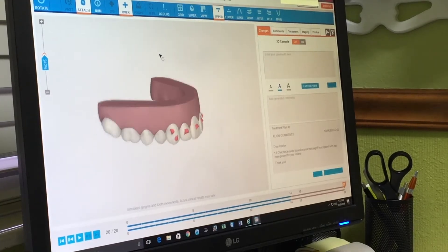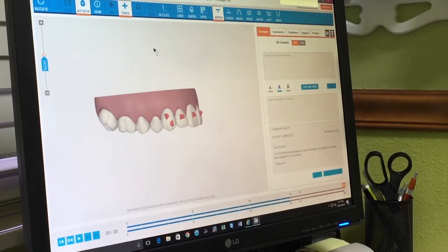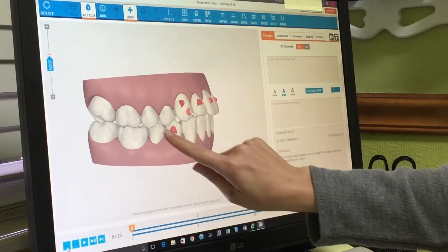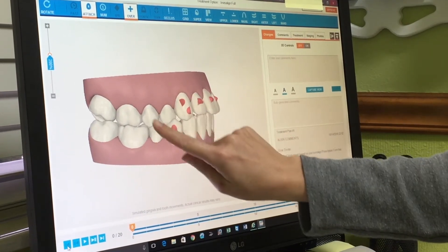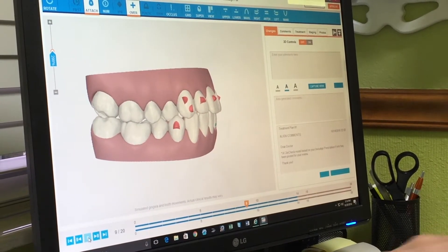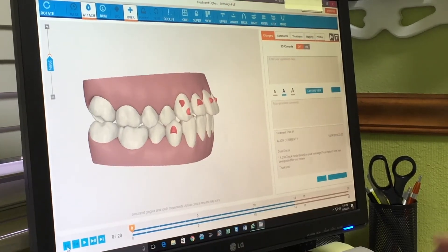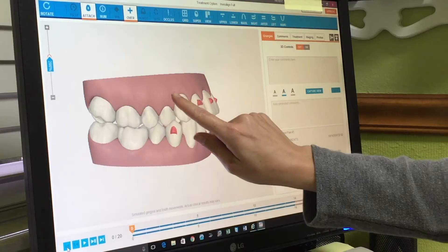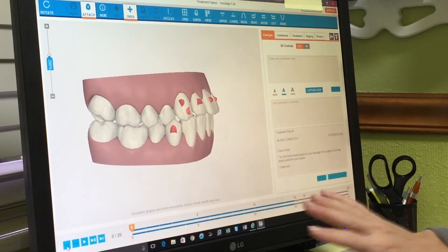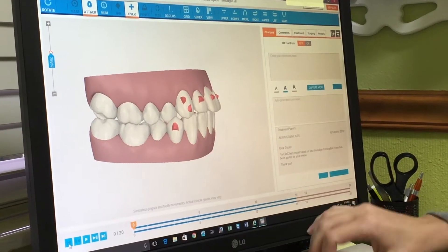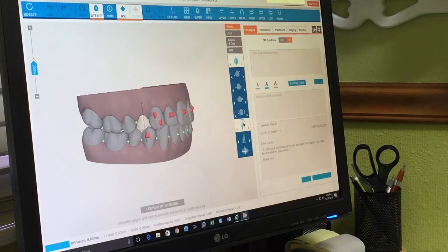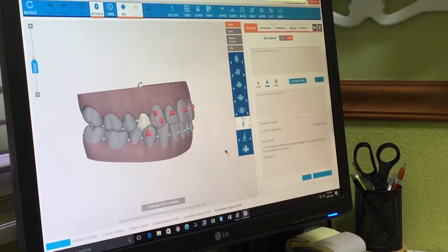Let's take an example here. This patient was scanned — focus in on this tooth here. If I just press play, notice that this tooth did not move whatsoever. If I go in and open that up, you can see that's where that tooth started and that's where that tooth finished.